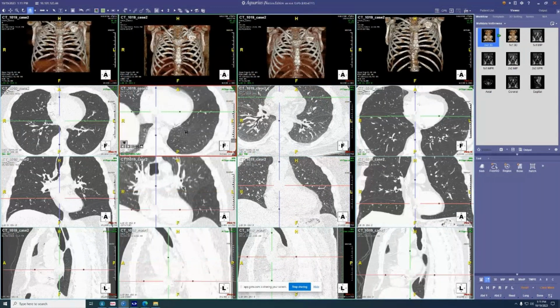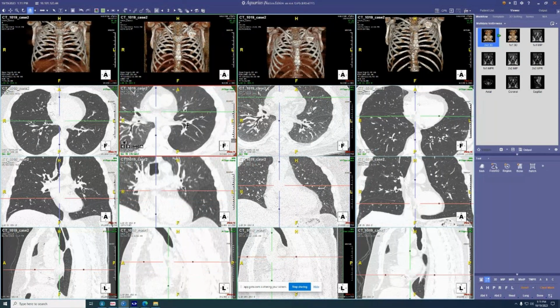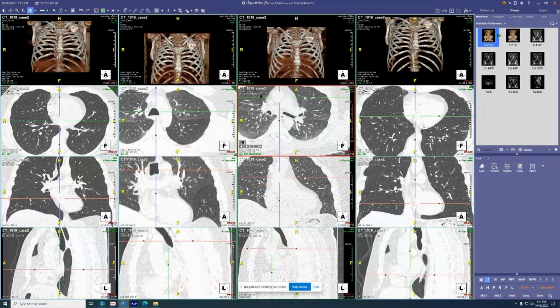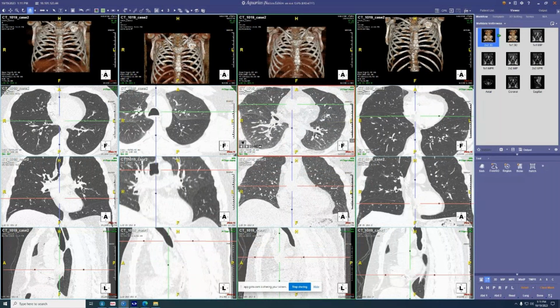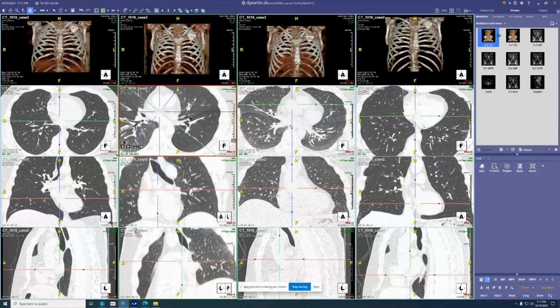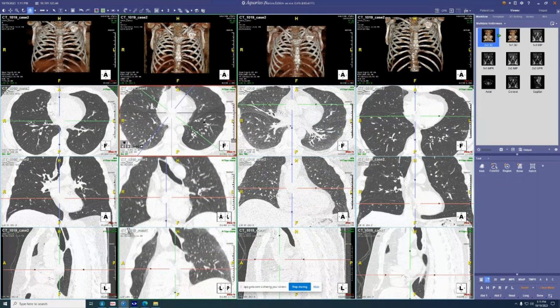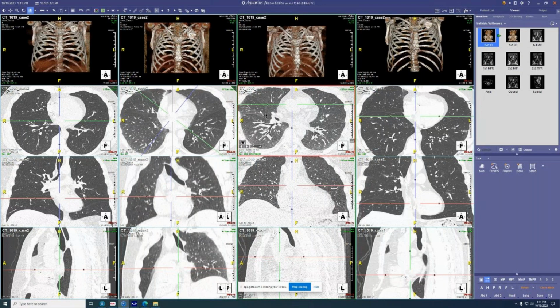Yeah, exactly. So this is small airway inflammation from asthma. And when he presented with the first scan, was that acutely, or did he come as an outpatient? It was kind of acute. So it was an outpatient, but he came in because he was worse symptomatically. We're not an ER place, but it wasn't like he had to go to the ER. He was acutely much worse. Okay, so maybe like a mild status asthmaticus, and then they treated him, and this is his follow-up, and it's like night and day.